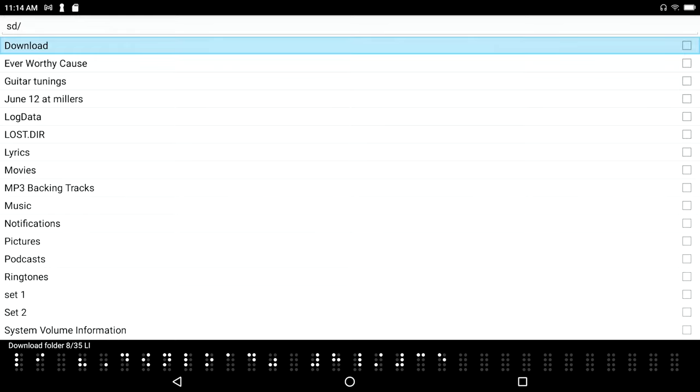And it's already copied everything there. So like I said, if you care about something you back it up. If you really care about something, you'll back it up twice. So I'm going to backspace to go back up to my list of drives.